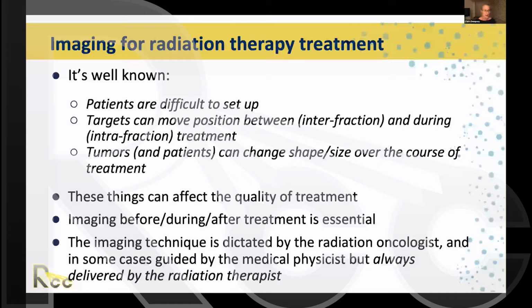So just as a bit of a background, and I'm sure you've heard all this before, so it's well known that patients can be difficult to set up. Some of the patients are in pain, they can't lie still for long periods, they're in uncomfortable and awkward positions as well. So we know that the targets that we're trying to treat inside the patient can move position both between fractions, so that's interfraction, and also during fractions, so during the treatment, and that's what we call intrafraction changes.